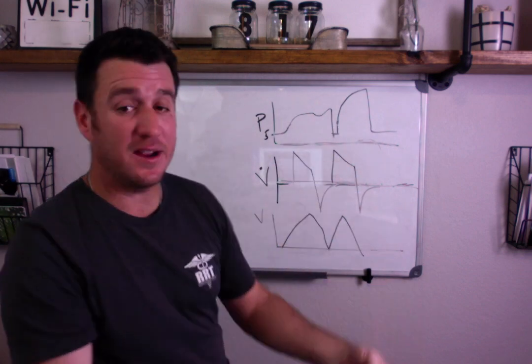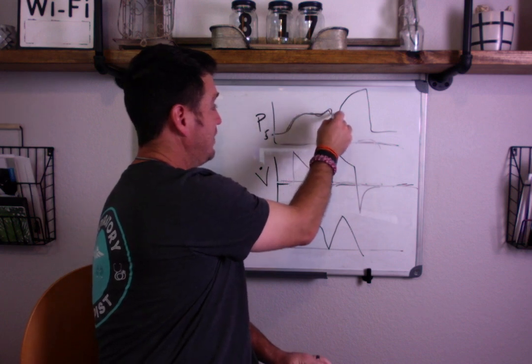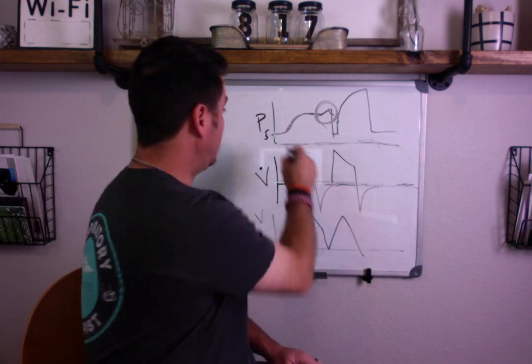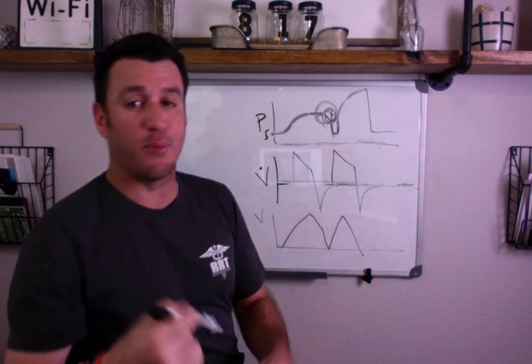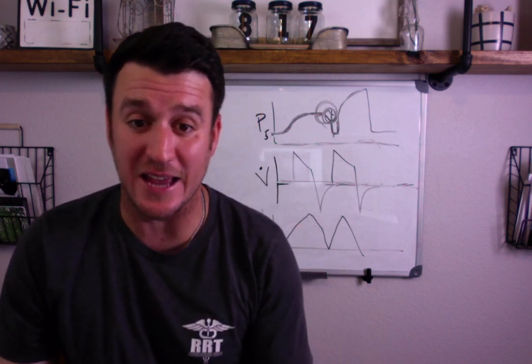Now what's happened here is that at the point in time when this breath was ending, another breath was triggered at that point. So the breath comes in, it's plateauing, and then you get another secondary drop in pressure, and then another breath has happened immediately. So you get what we call breath stacking.